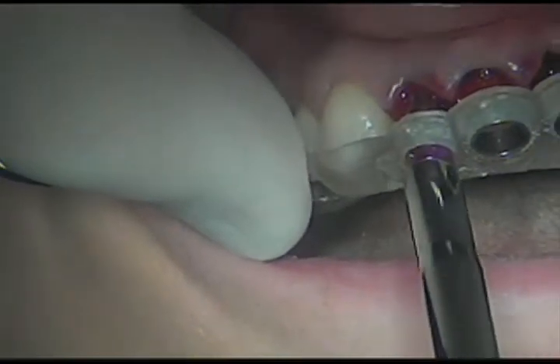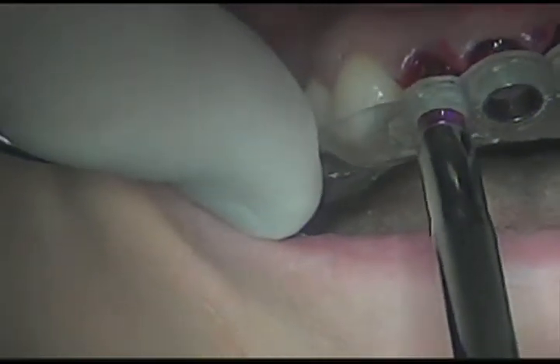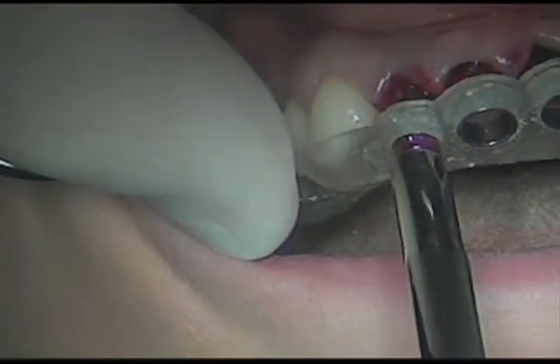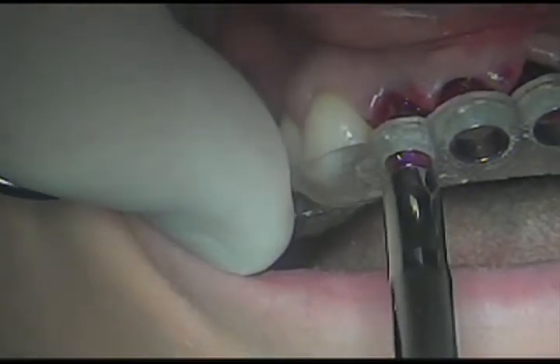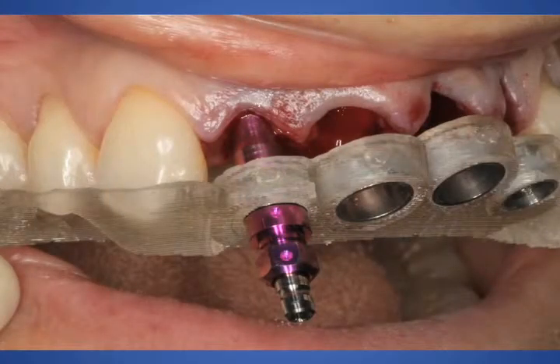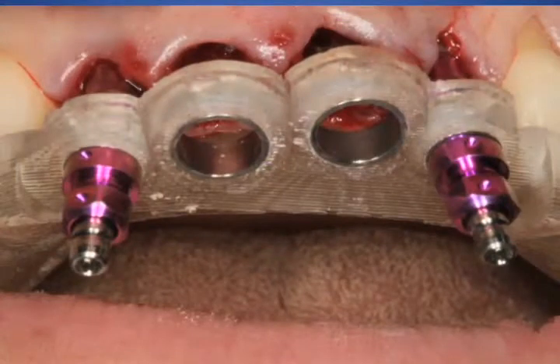You can see the little markings, the little dots, in the Replace system. We want one of those dots to be towards the facial. That's where one of the lobes is facing towards the facial, which will allow us better final abutment creation and better aesthetics in the long run. So that little dot is facing towards the facial. And here's a close-up view of that. You can see we went all the way to the top. Very precise, very exact, very difficult to make an error in this situation.